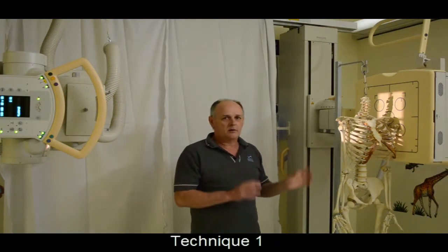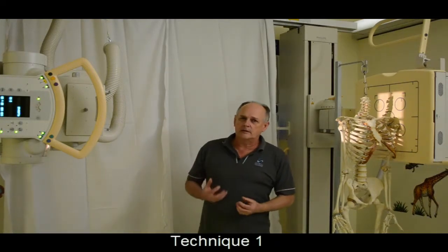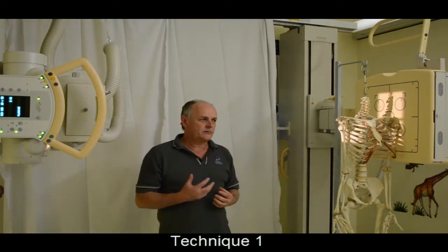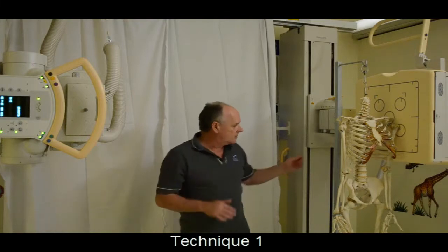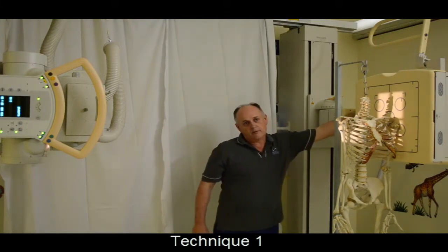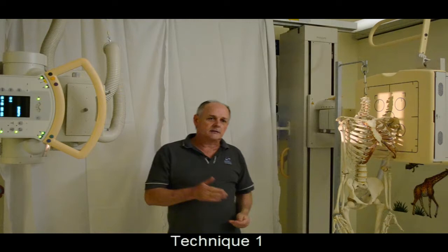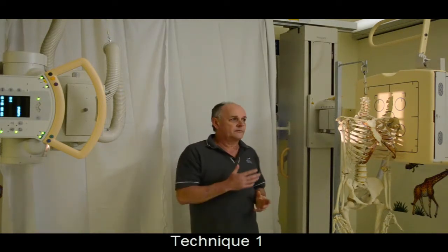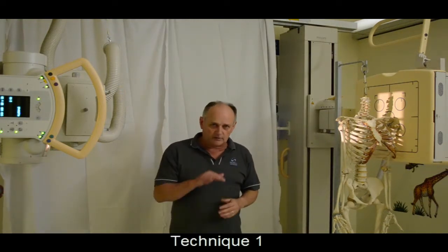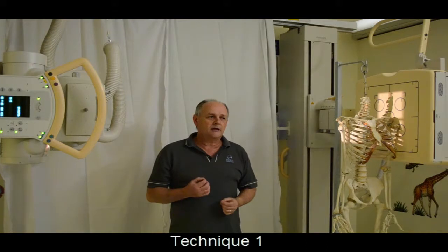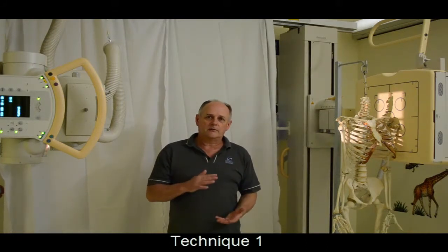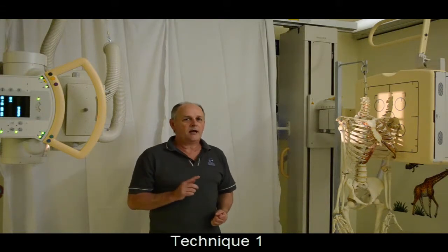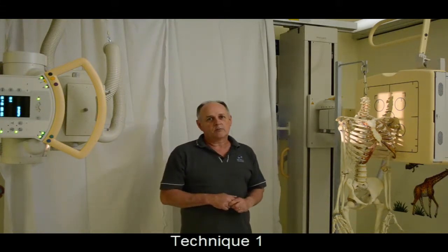The difficulty in this concept is that as radiographers, we are used to thinking about the right angle beam. For table bucky radiography it's a vertical beam, for wall bucky radiography it's a horizontal beam. We are used to thinking about the horizontal beam being in the center of the field, and that is not the case when I angle the tube, which I am going to do now.